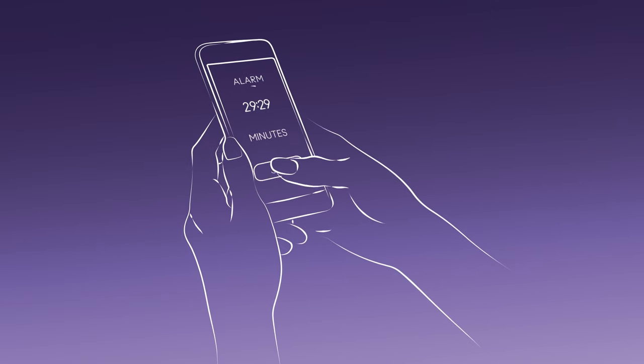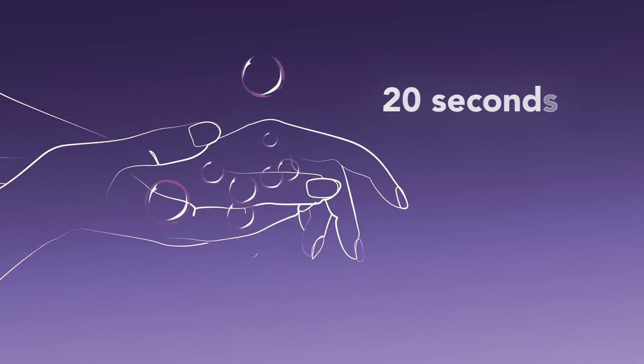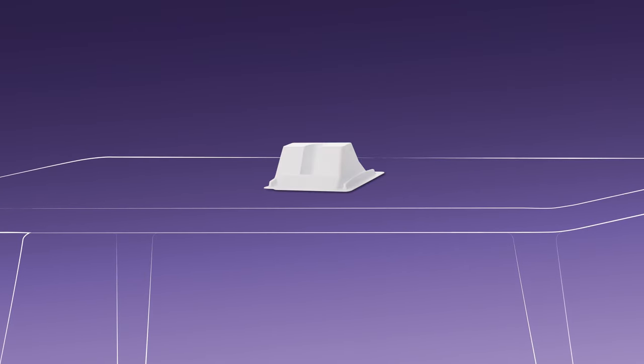Before you begin, be sure you have a way to time your test. Next, wash your hands thoroughly with soap and water for 20 seconds and dry. Then, place the test stand on a flat surface.